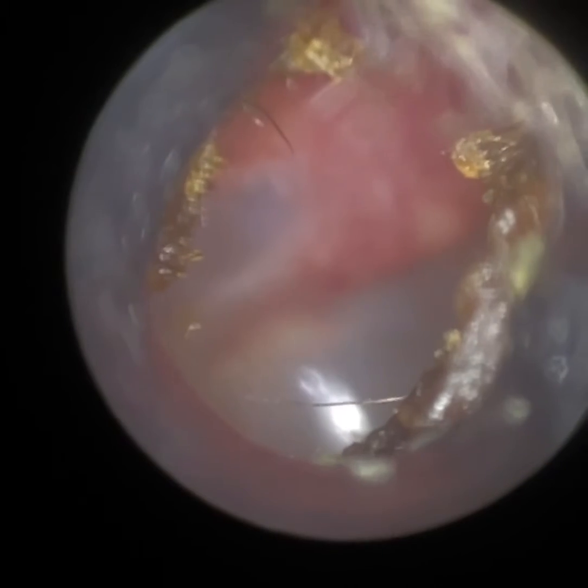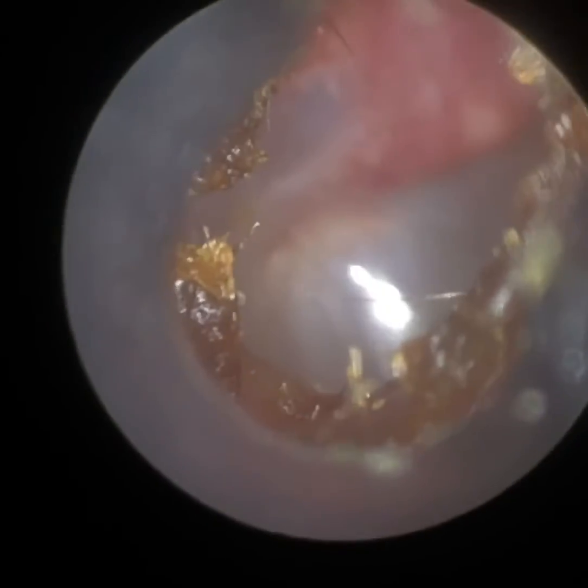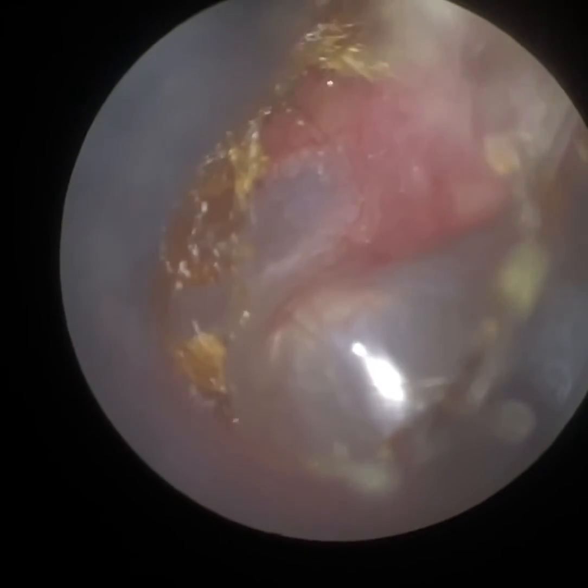I decided to leave all this peripheral wax. We don't want to risk causing the patient any trauma or injury because we can see the eardrum. Fortunately, the eardrum's intact — no trauma caused.